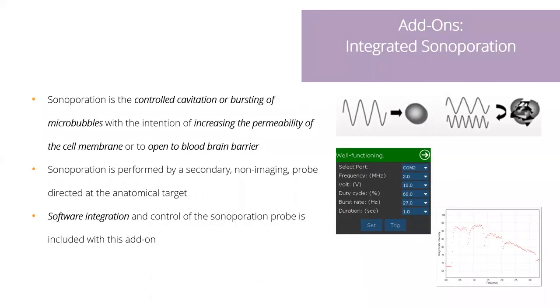And the last add-on is for sonoporation. So we talked about microbubbles initially when talking about imaging the vasculature, and we hit the bubbles with a specific sound wave and they reflect the sound back. That's what we do for imaging.